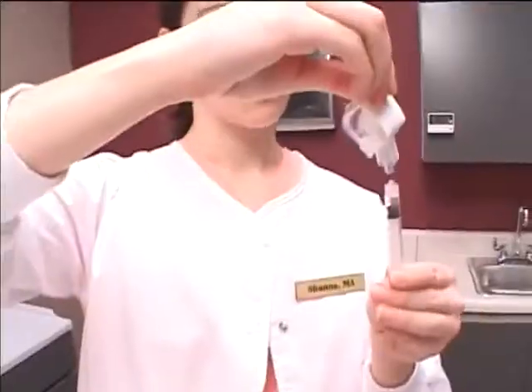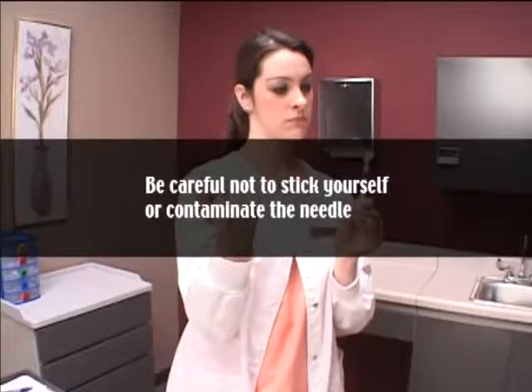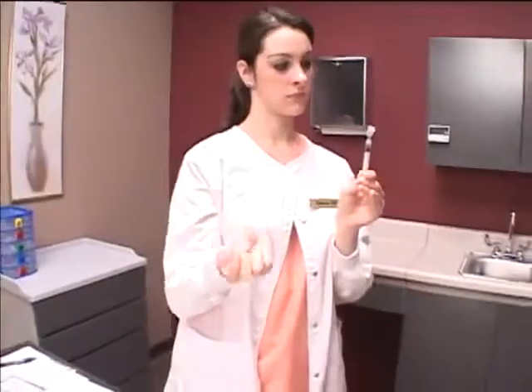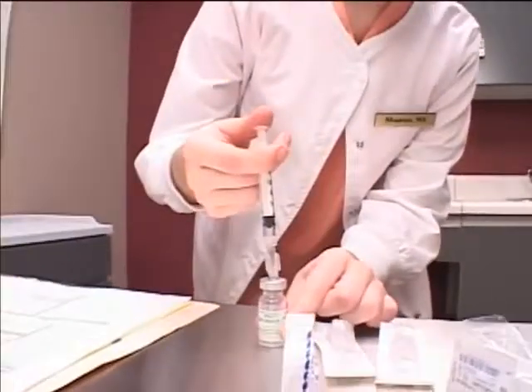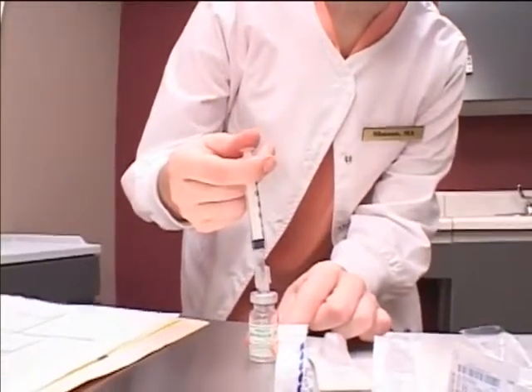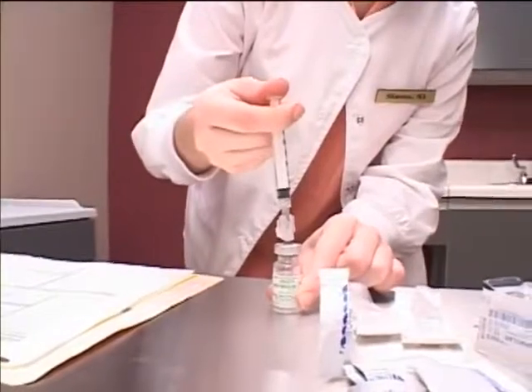Draw air into the syringe equal to the amount of medication to be drawn up from the second vial. Unwrap the needle and place the needle on the syringe. Remove the cap from the needle, being very careful not to stick yourself or contaminate the needle. Place the cap on a clean surface. Inject the air into the second vial and remove the syringe and needle from the vial. Make sure the needle does not touch the liquid.